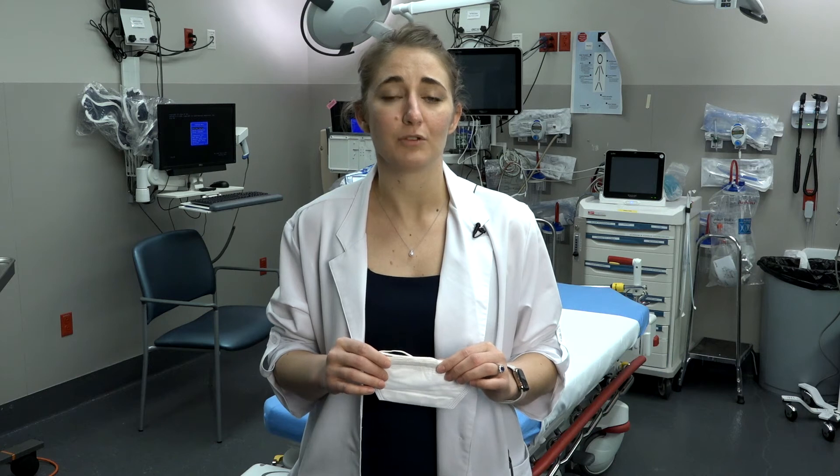Today we're going to talk about the appropriate way to wear an N95 respirator when protecting yourself from airborne respiratory droplets.